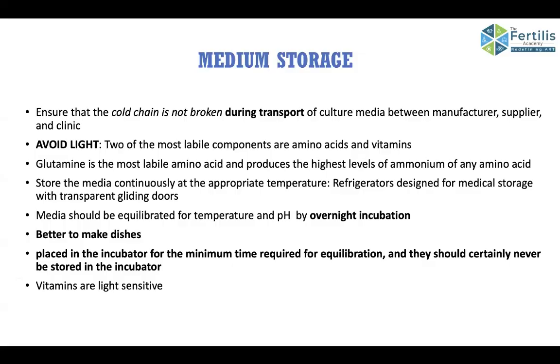You have to understand that it's an ecosystem. Plastic, media, and oil. It's an ecosystem, and there is a certain degree of equilibrium which sets in these dishes after 14 to 16 hours of incubation, and you don't expect that kind of equilibrium coming in half an hour of incubation, even if the media is incubated.